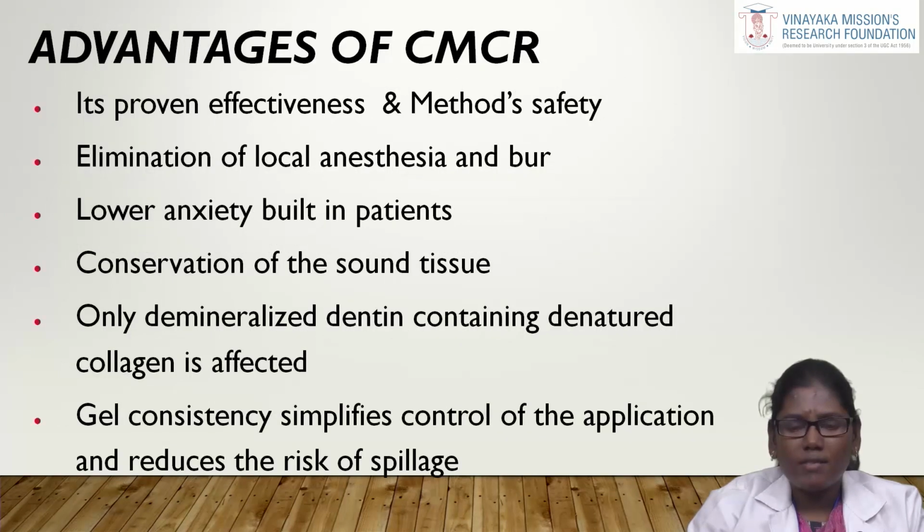Moving on to the advantages of the chemomechanical caries removal system, it is proven to be an effective and efficient caries removal agent with safety, and this system eliminates the usage of local anesthetic agents and rotary instruments. It also lowers the anxiety built up in patients, which reduces the fearful response of pediatric patients.